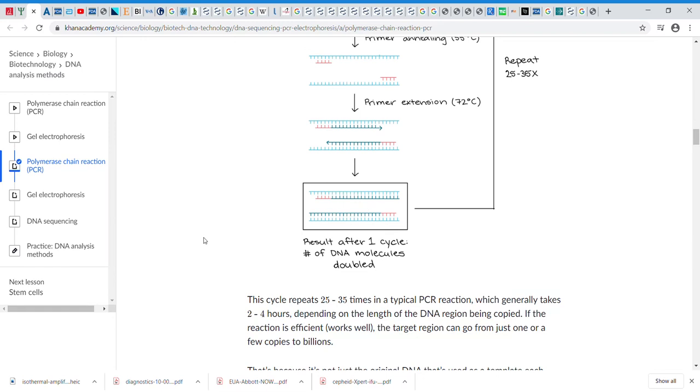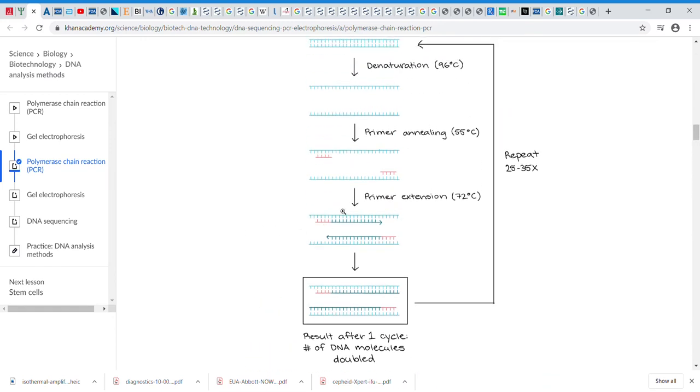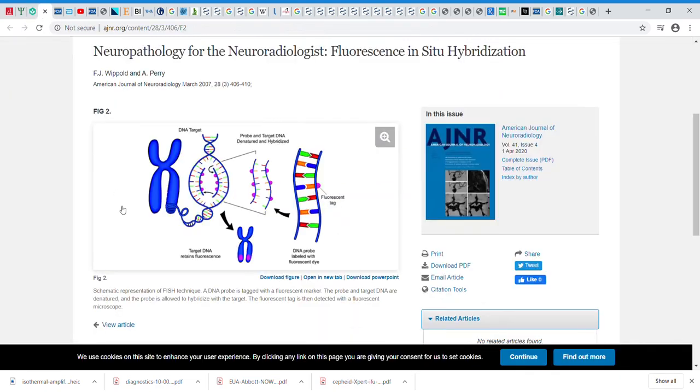After you get more, you could substitute something else for the primer, called a probe. The idea of a probe is something that attaches, and this probe has a fluorescent tag. They have different ways of tagging, but fluorescent is one way, and the machine could pick it up. It's like, oh, it lit up. Hey, I found a thing of interest. Because you don't want to just find any old DNA or RNA. It might be some other viruses, and I don't really care if I have the flu or this or that. I only want the coronavirus, COVID-19.